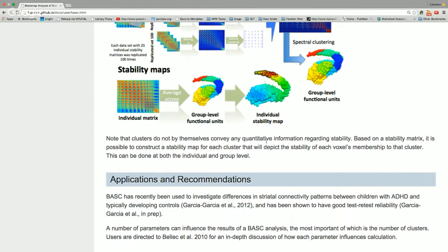You can generate other samples of the parcellation from whatever this big hidden distribution of parcellations of the basal ganglia might look like for that individual. And then you can do that several times, say 1,000 times. And then what you can get out is what they call a stability map. So that's here, right? Where what you see in each of these colors is related to how stable is that voxel, how consistently is, say, this voxel here mapped to that cluster that's marked with black. So you see these things are never done, right?